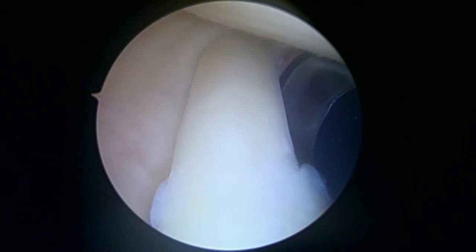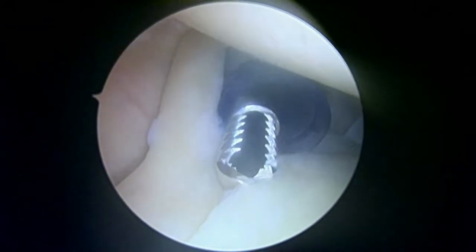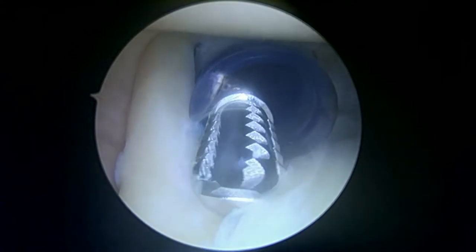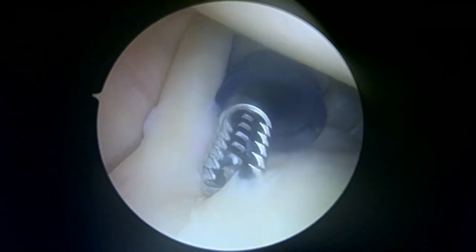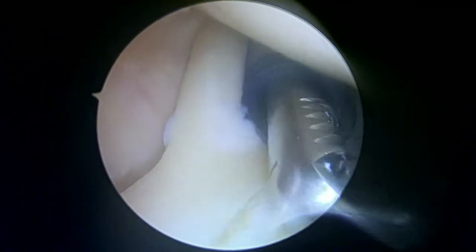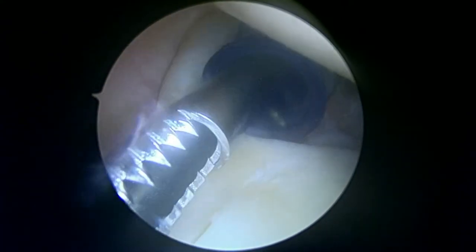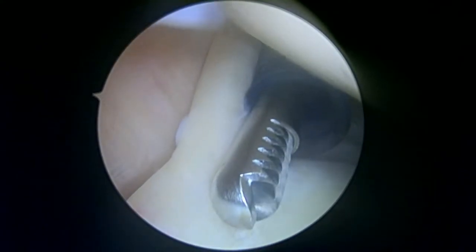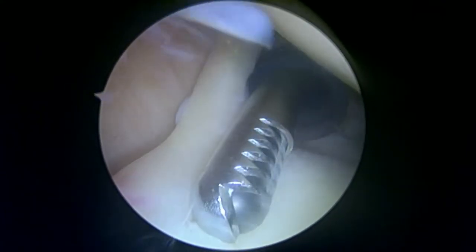Just pretty much by definition, what we're seeing already is kind of a type 1 SLAP lesion, meaning there's some degenerative tearing. See that? It almost rises to the level of being a meniscal type of injury, like a bucket handle tear, which would make it a type 3. But regardless, this is what shows up on the MRI scan and that sort of thing. It doesn't really show up great on an ultrasound, but certainly on an MRI scan or an MR arthrogram.